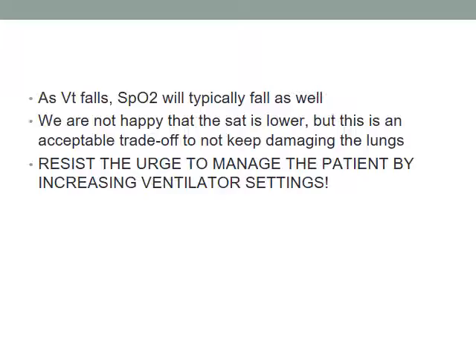This is actually a screenshot. Patient's tachycardic, sats 72, febrile, hypertensive, pre-ECMO. Heart rate down, blood pressure okay, sats at 94, temperature lower, he's on ECMO.